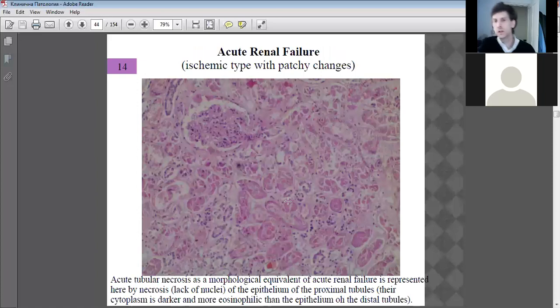Okay, so the renal failure. This is a Bowman's capsule. You can see lots of tubules here in this section. It's hard to see. There's only a few blood vessels, not a lot. Perhaps only here in this glomerulus can you see a few of the vessels. Okay.